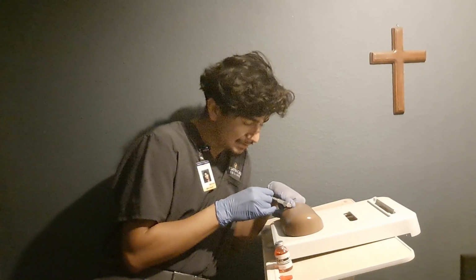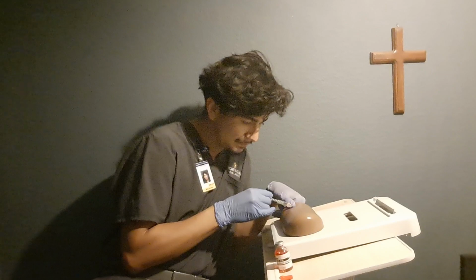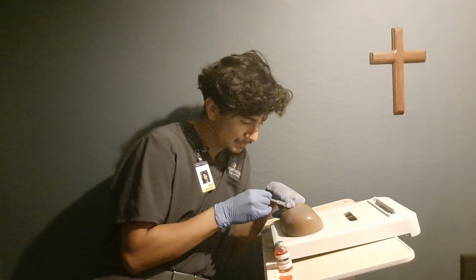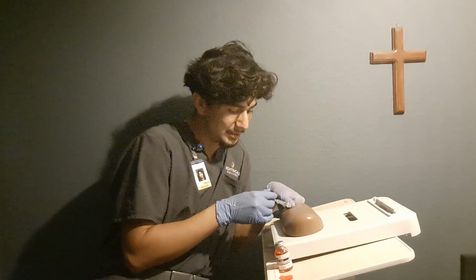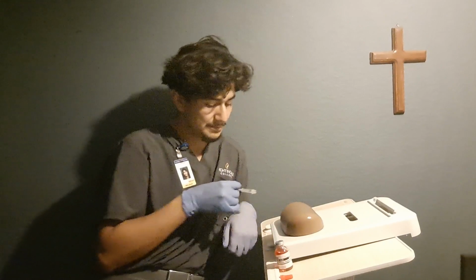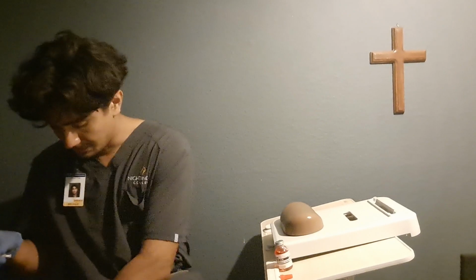Okay, so I'm seeing, what's it called? A 6 millimeter to 10 millimeter bleb is what we're looking for. It should look like a mosquito bite. Okay, and then once you remove the needle, you're going to go ahead and place the gauze on the patient's site.